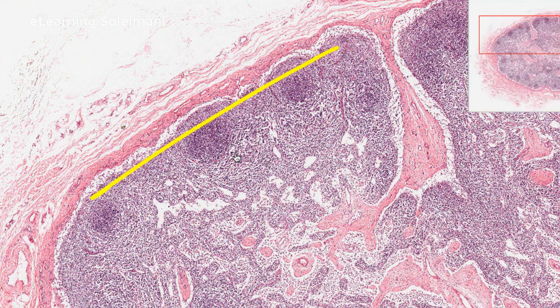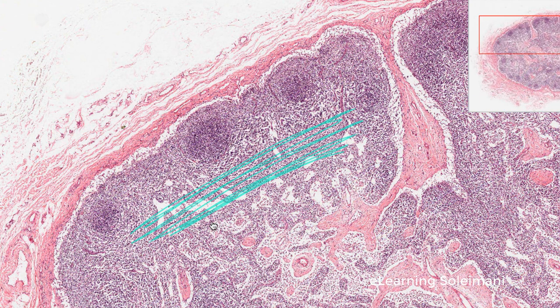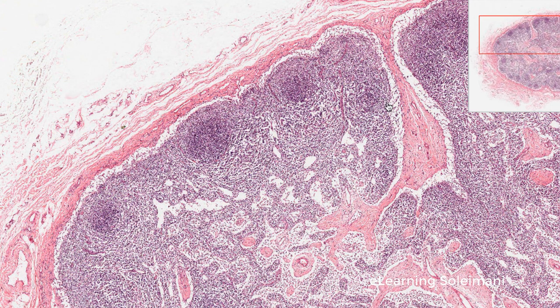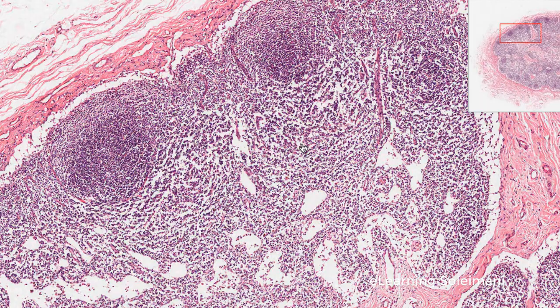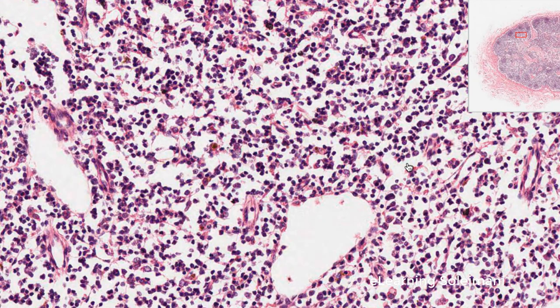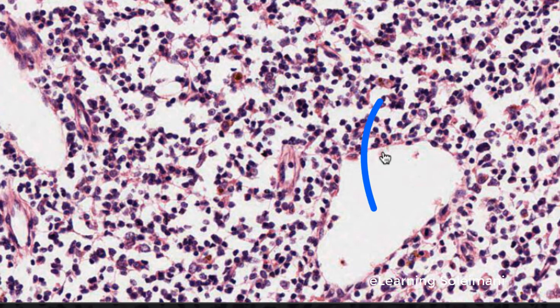Between the regions of the cortex and the medulla, there is an area called the paracortex. The paracortex of the lymph node is a T cell zone, which contains mature T lymphocytes to react with antigens, where the circulating lymphocytes leave the high endothelial venules to enter the node.